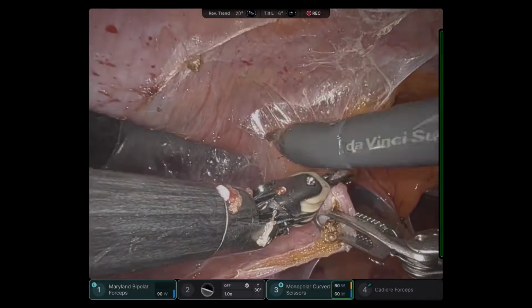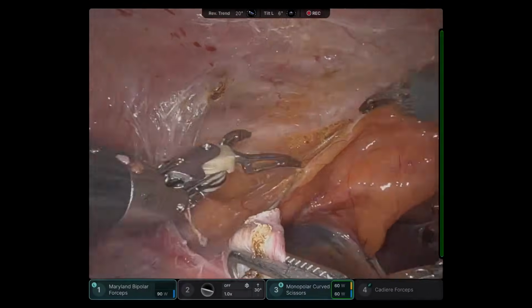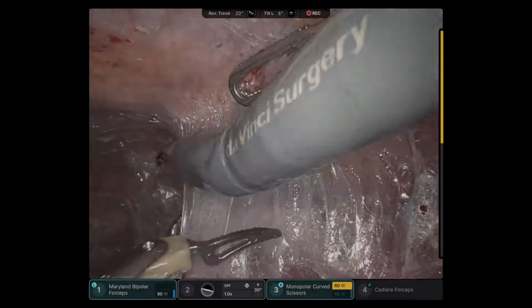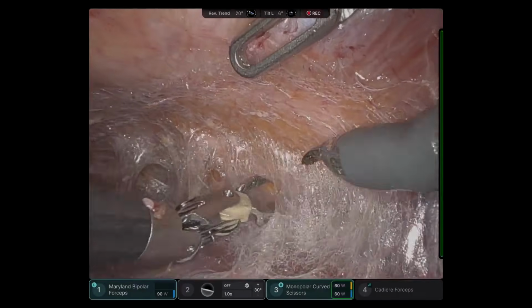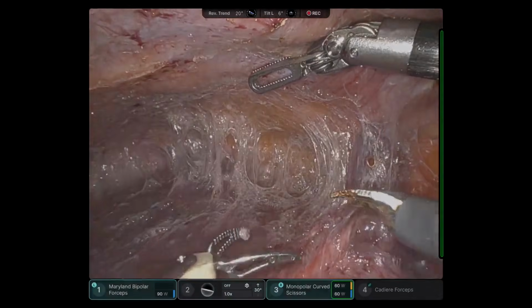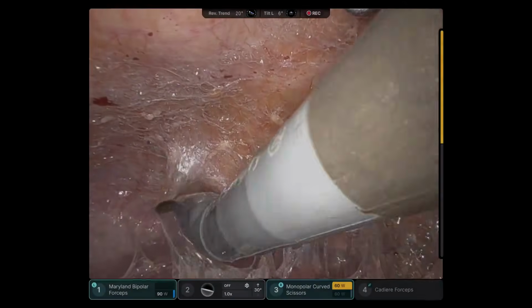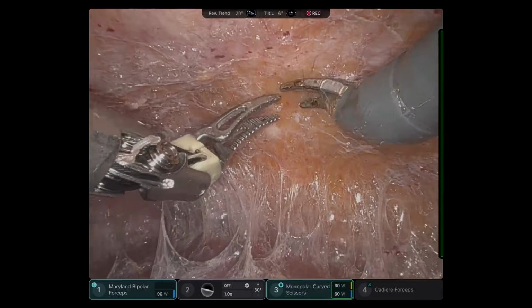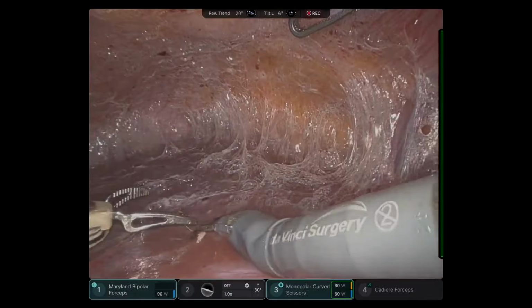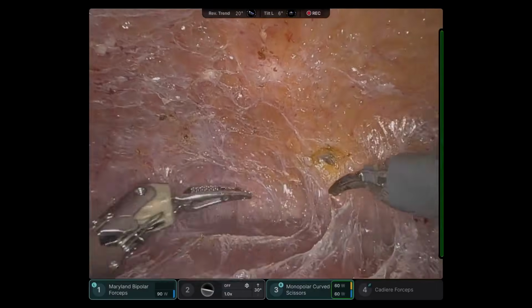You can see a lot of spots there, and that was mostly fat necrosis. She has no history of any cancer, but I still sent a specimen to pathology, which showed granuloma changes, or sorry, giant cell reaction. That was a small piece I was going to send, but I found other pieces that I ended up sending to pathology.